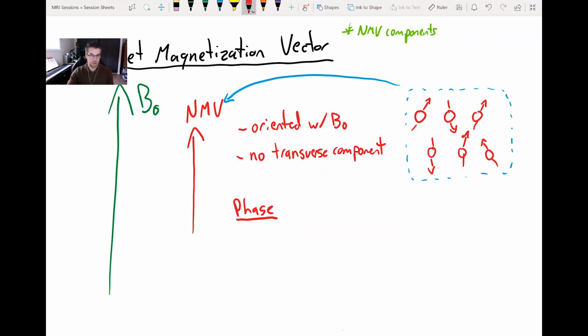Okay, before we move on to that, Zara asked to explain why the net magnetization vector is oriented upwards again. That's because the name net magnetization brings us to the concept of how each hydrogen atom's own individual little magnetic field that I drew earlier, how do they add up? Is there a surplus of magnetic fields in any specific orientation, or do they all cancel each other out like they do at rest?